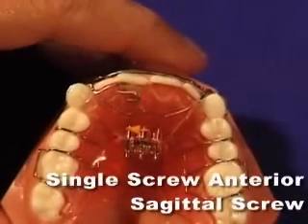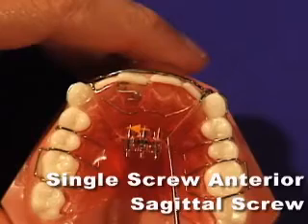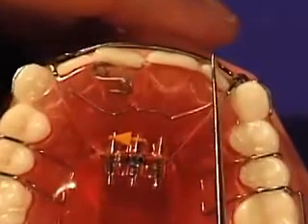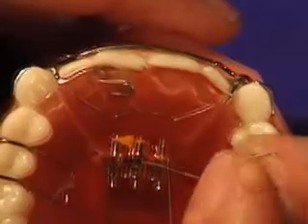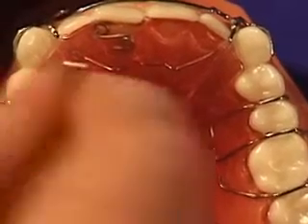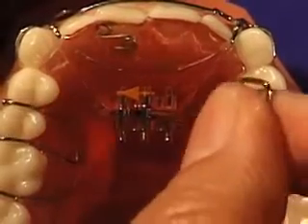The single screw anterior sagittal design is dedicated to just moving four anteriors labially. The adjustment procedure for this is very simple. Place the key into the slot farthest from the tip of the arrow and turn in the direction of the arrow until it stops. Every turn is equal to one quarter millimeter of travel.